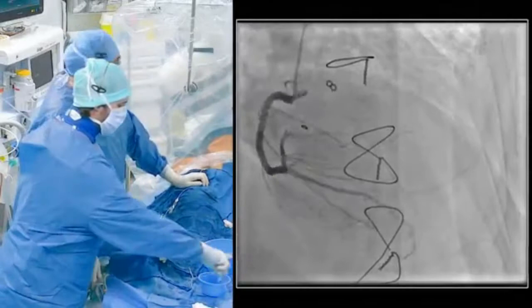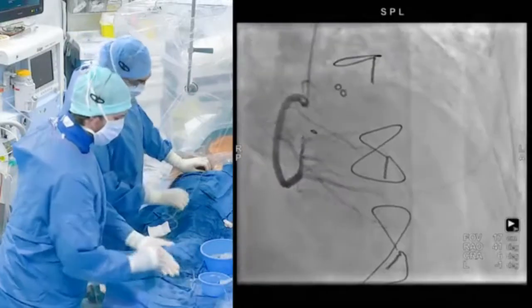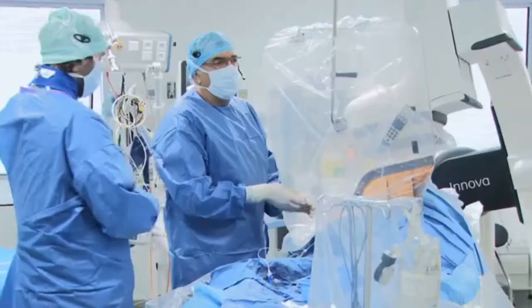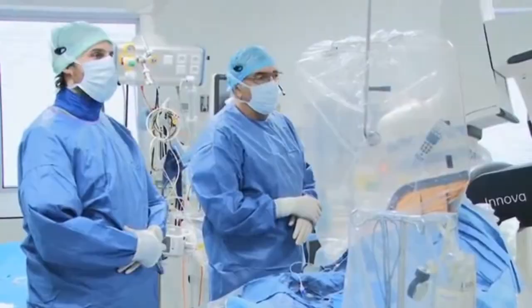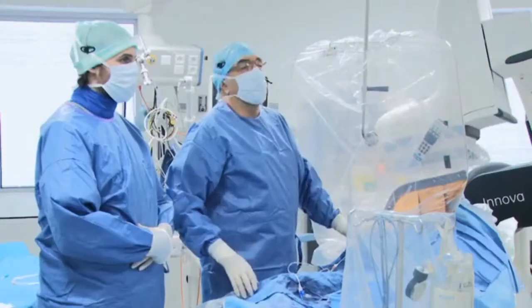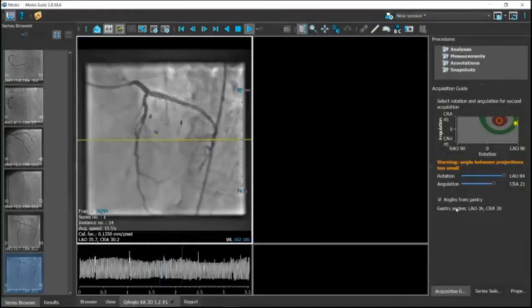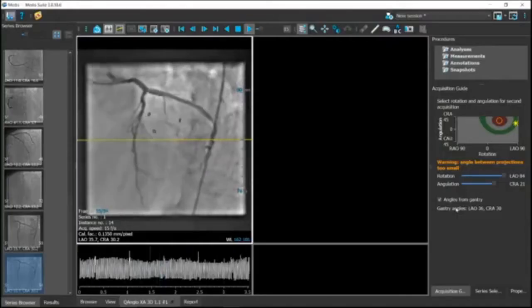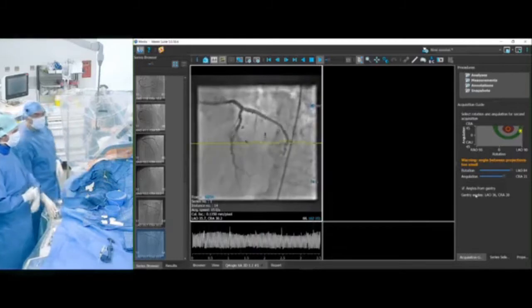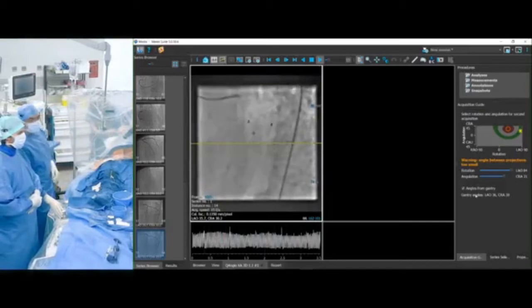Definitely it's a single-vessel disease of the LAD, and now we will come back to the LAD to have two views under nitroglycerin. Because on the angiography it was not critical, what we can do is to have an evaluation by QFR. This is a first view in LAO cranial, and according to the calculation we will move to more LAO up to 84, close to 90, with a cranial 21.